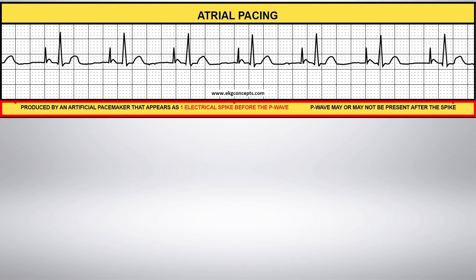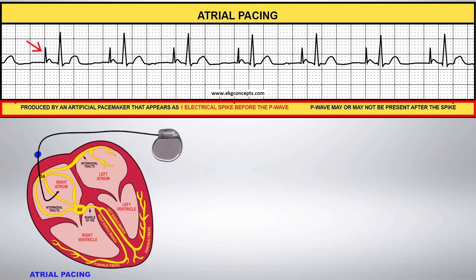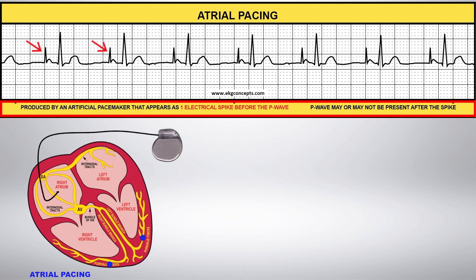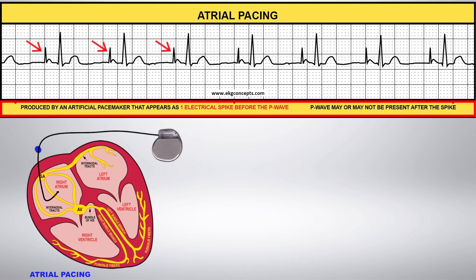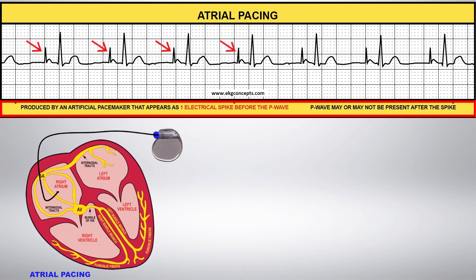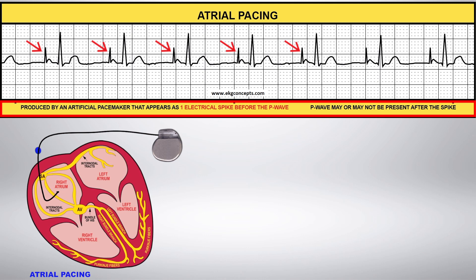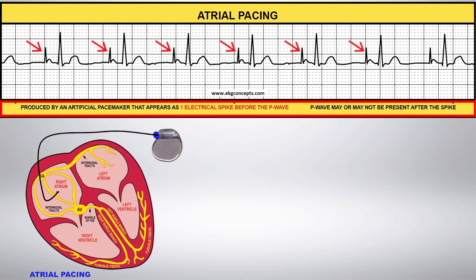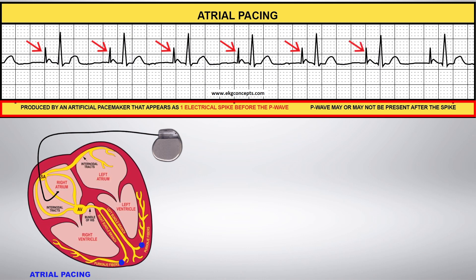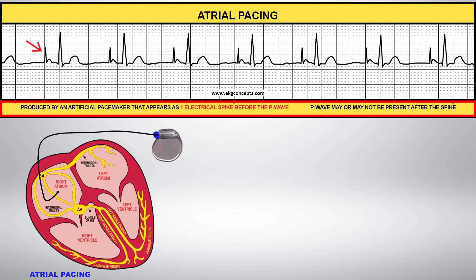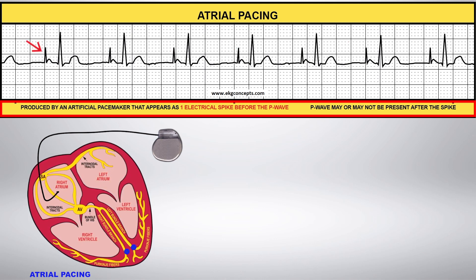Pacemakers are devices that electronically stimulate the myocardium, initiating mechanical contractions. Pacemaker leads may be placed in the atria, the ventricles, or both. Here you have an atrial pacemaker in which the pacemaker lead is inserted into the right atrium. Atrial pacing stimulates the atria, then the impulse follows the normal conduction pathway through the ventricles.